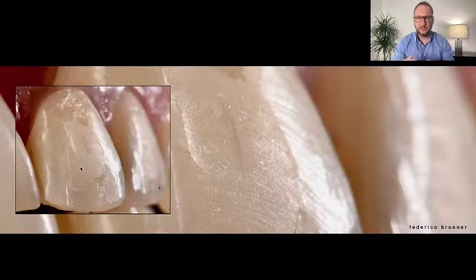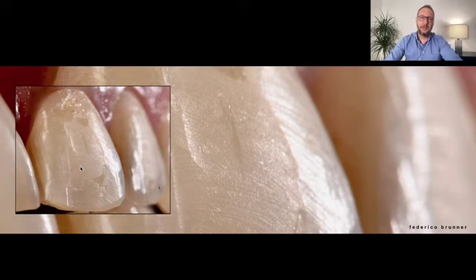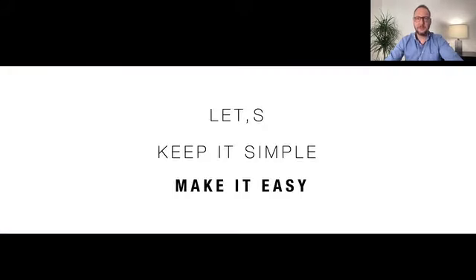We put a lot of effort to move teeth to a beautiful position, and then in the most important part, when the patient is going to have their smile, we are in a rush or we don't have enough time, and then we use these burrs, and by using a microscope or magnification, we can see these defects. And here again. This is something he's been collecting for a long time, patients that he referred to orthodontists, and when the patients came back to his clinic, they were like this. So this is not the signature that you want for your treatments, right?